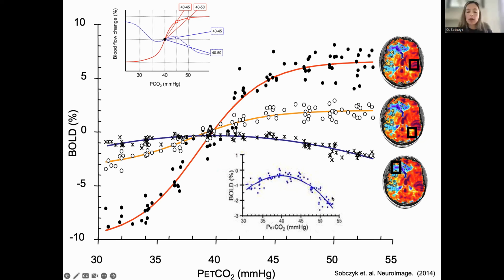So in summary, an important principle derived from this model and data was that the absolute magnitude of the stimulus has to be adequate to maximize the ability to identify areas of reduced vascular reactivity. So it emphasizes the importance of precision in the administration and measurement of the vasoactive stimulus. You have to make sure you know how much CO2 you're giving and that you're giving enough.